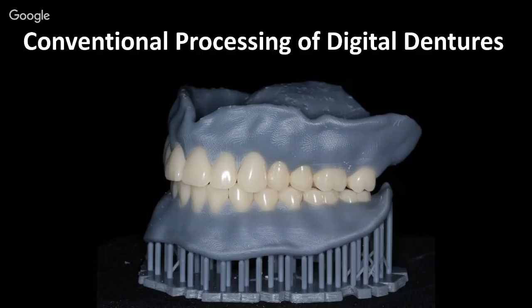It doesn't take much. Remember, this is, for lack of a better term, your cement between the tooth and the base. So it doesn't take much. And I have a paintbrush, and I'll just take that paintbrush and paint a little into the well of the tooth, stick the tooth in, use the paintbrush to wipe off any excess that may have flowed into the adjacent socket, and then I'll tack cure that into place with just a composite curing light, and proceed around the arch that way until you're done.